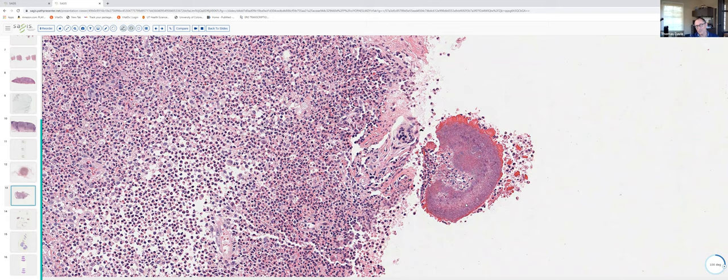To summarize: in actinomycetoma, you see filamentous branching bacteria on Gram stain. In eumycetoma, you see hyphal elements, frequently pigmented. Of the three — botryomycosis, actinomycetoma, and eumycetoma — in my experience the fungal organisms of eumycetoma are easiest to see and identify with certainty in H&E sections, although we always confirm with PAS or GMS.